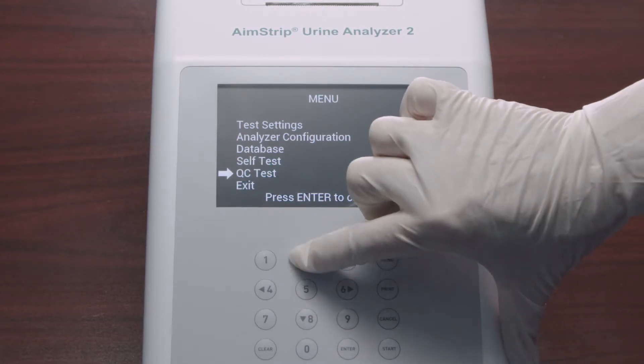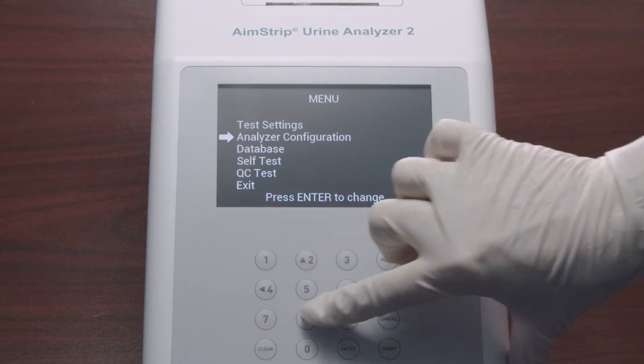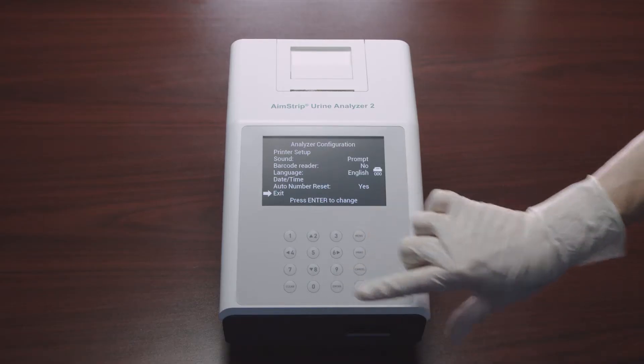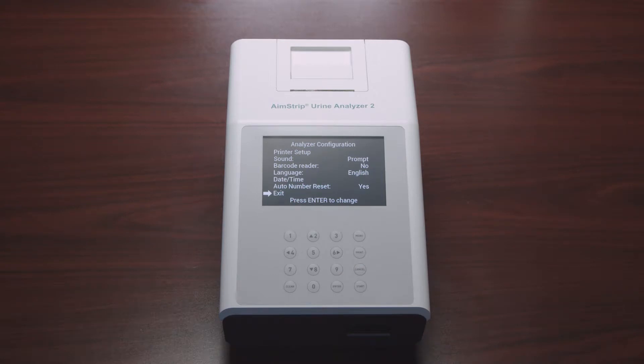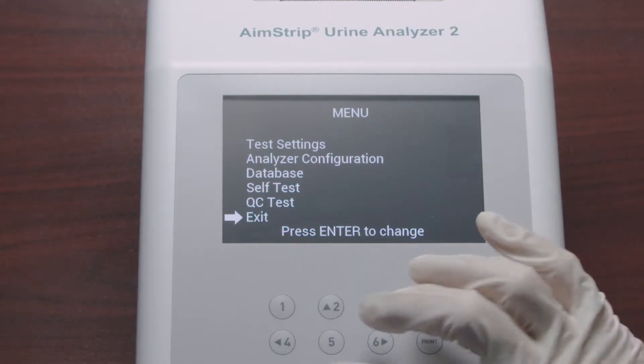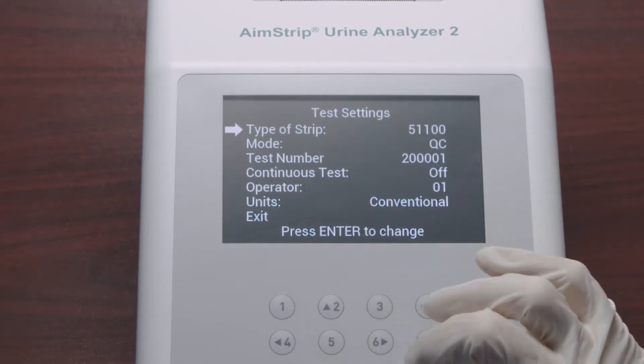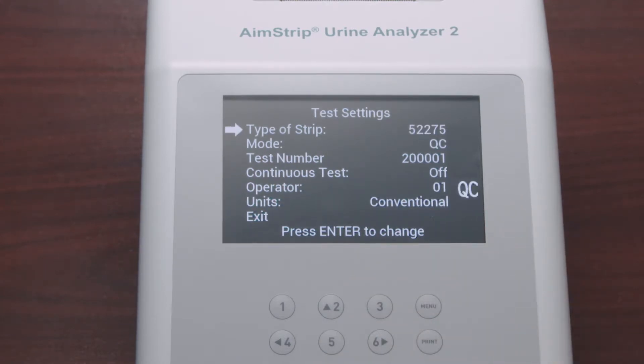Use the up and down arrows on the keyboard to move along the menu and press Enter to select an item — this is true for all menu screens. Start by selecting Test Settings to input the type of strip and press Enter to change it. Each strip type name defines the number of test parameters, and each press of Enter cycles through all options.